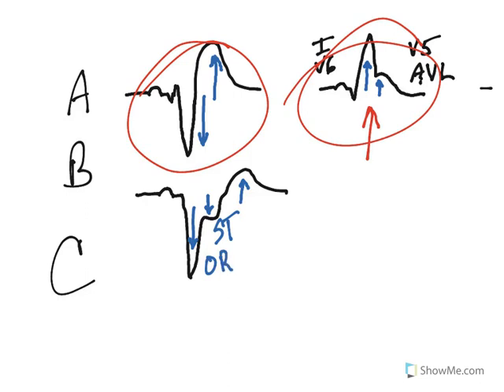Which actually, this is the one I drew was not a QRS, but that's okay. So I've got this downward deflection of the QRS, and I've got this depressed ST segment, right? So here's my ST segment depression. I have a downward QRS, and that is concordance. Concordance is bad. We don't want to see concordance, okay? And this is Sgarbossa criteria B.